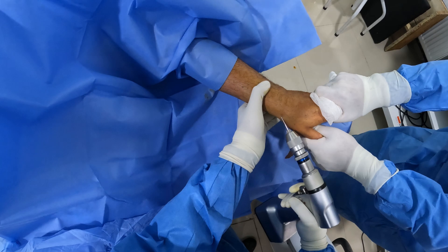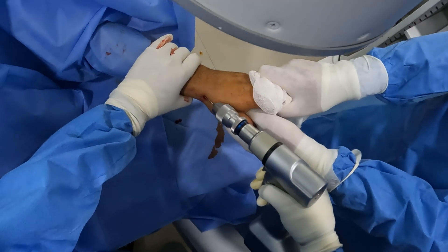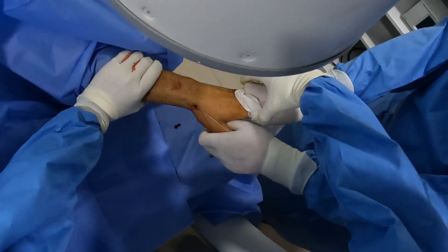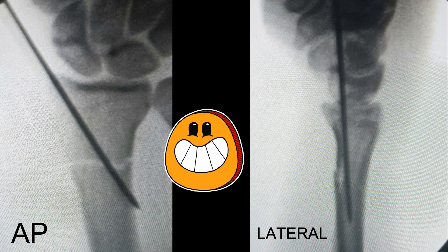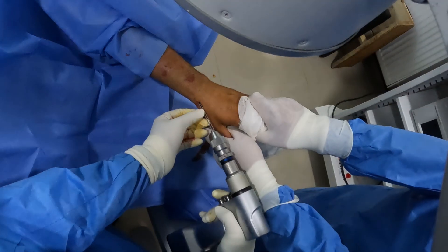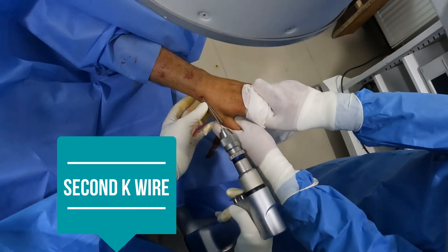In small bursts, I'll try to go across, and once the second cortex is achieved, I know that both cortices have been pierced. I'll take the C-arm view. Here you can see the AP view — the K-wire has gone across the fracture site. The lateral view shows the K-wire is inside, so we need two views to confirm the position of the K-wire. Once this has been done, I'll place the second K-wire.